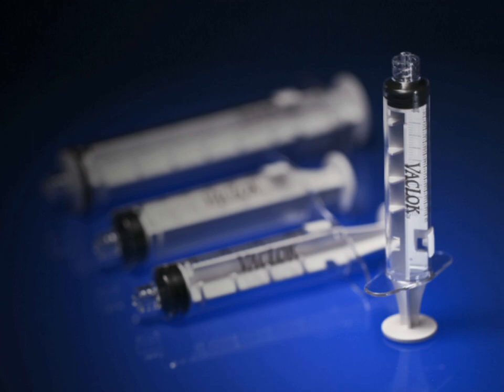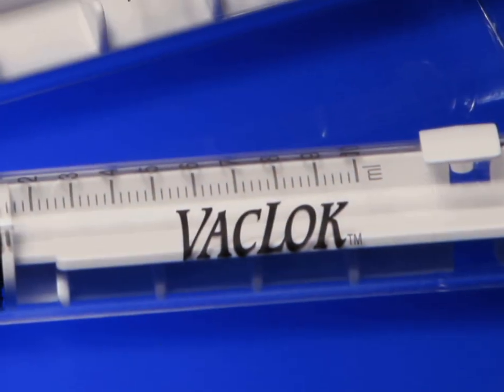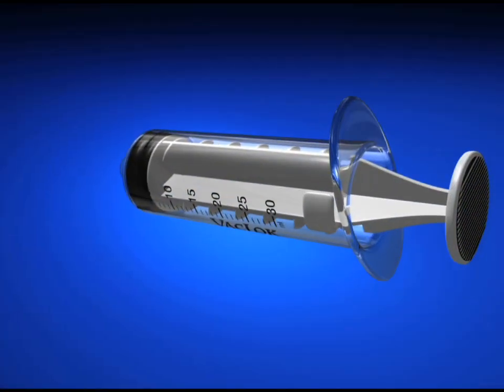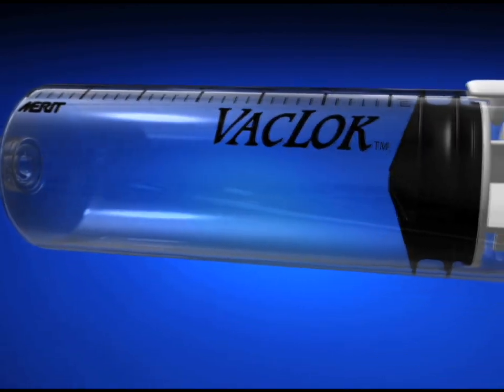The Vac Lock Syringe, a unique innovation developed by Merit Medical for use in abscess drainage and thrombus aspiration, to help overcome hand fatigue that may be associated with these procedures. The Vac Lock Syringe has been designed to create a sustained negative vacuum which minimizes hand fatigue and increases procedural efficiencies.